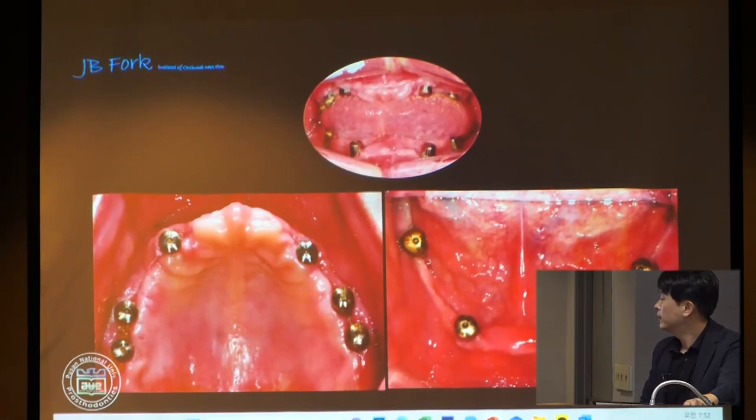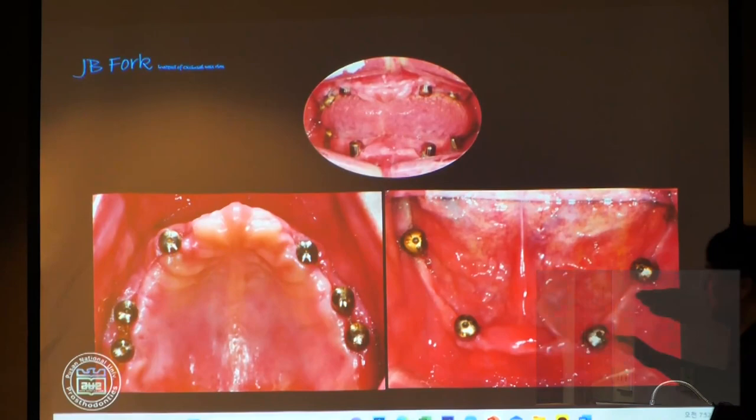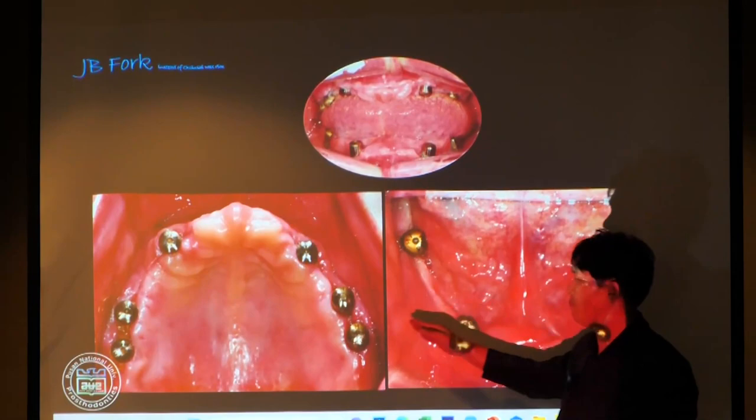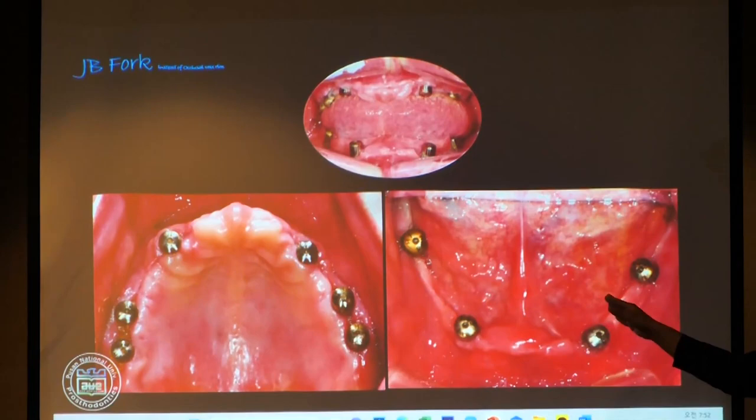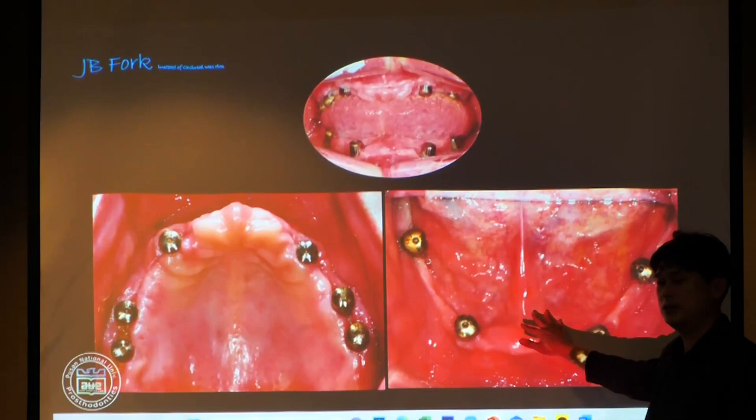So in this case, the implant case is very good. Why? Because there are definite references in this implant location, you know? So it is very easy to merge together. Yes, if there is no reference, we have to search for the irregularity of the ridge to merge it together. But in implant cases, it's very simple.